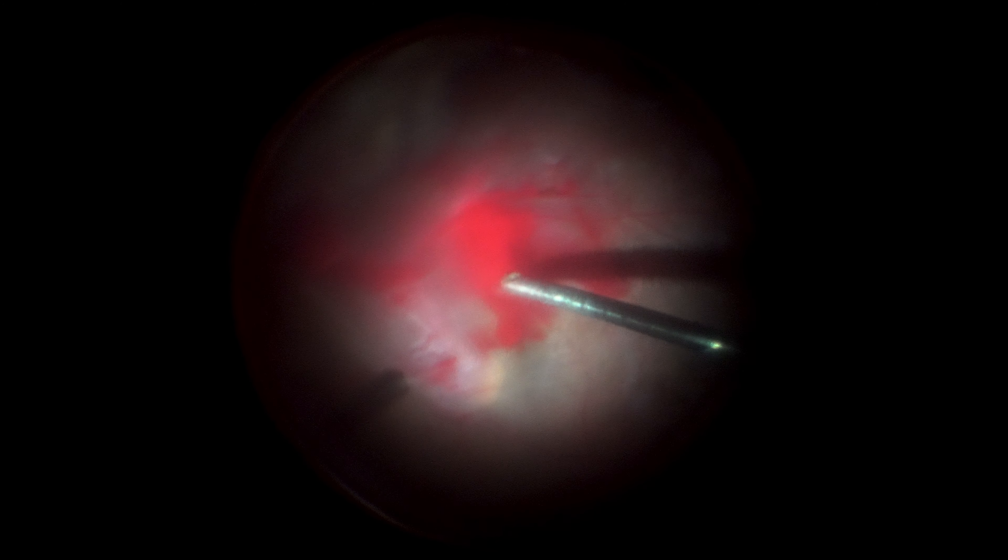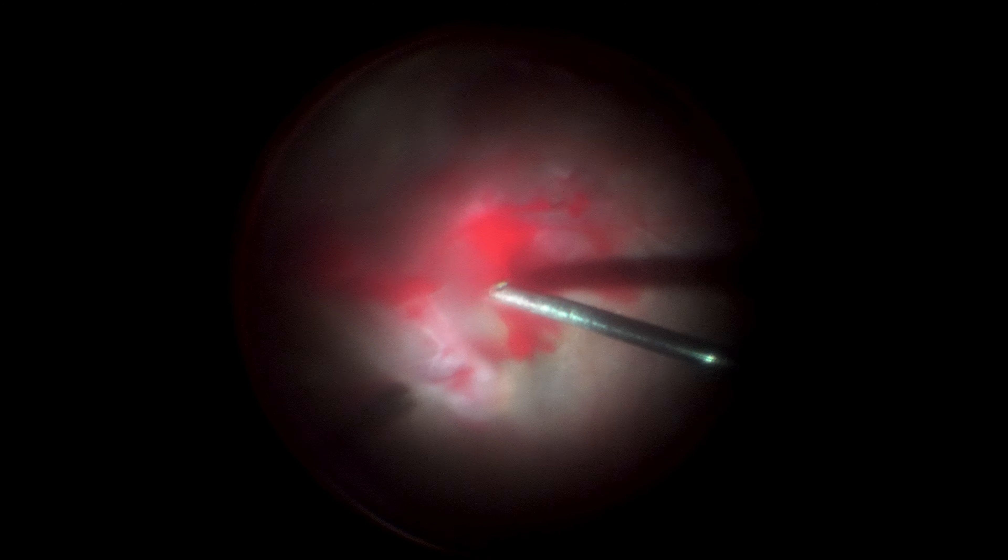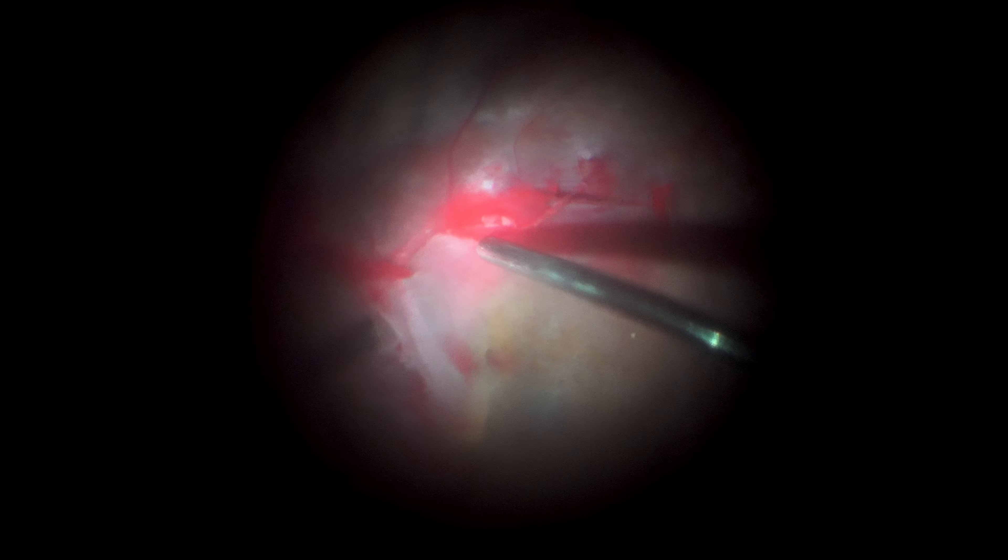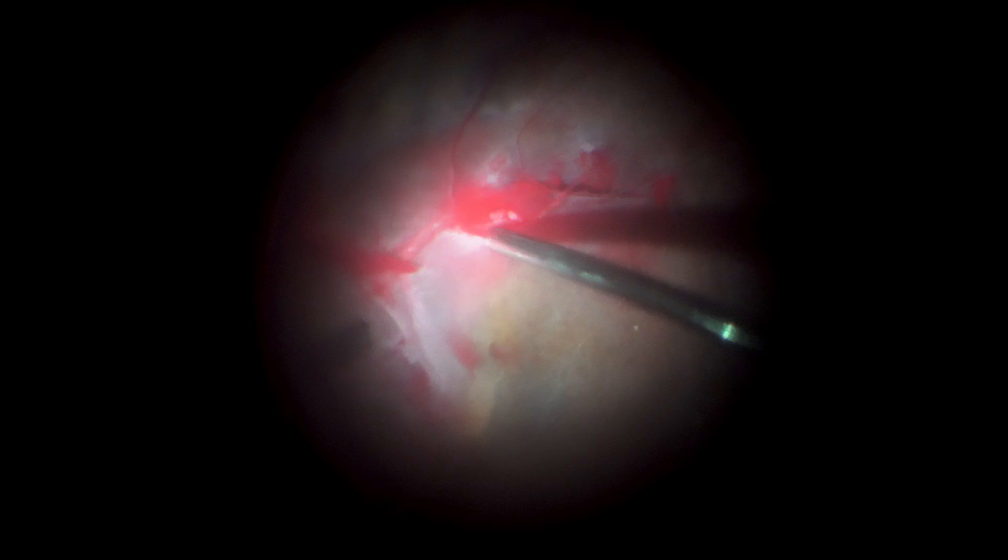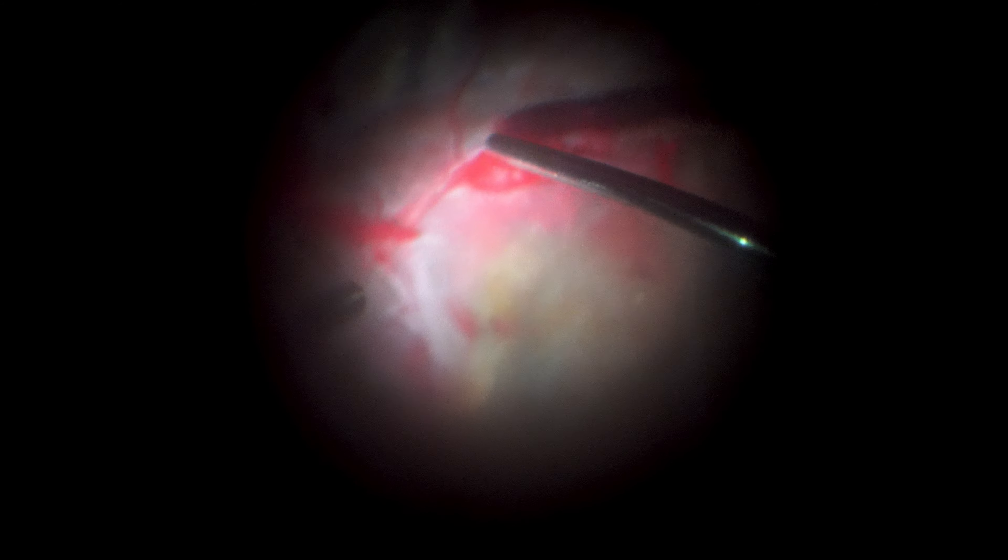A backflush cannula is used to remove blood passively. The light pipe helps with blood aspiration, bringing small clots to the backflush cannula tip. Raising intraocular pressure helps control bleeding at this time. The smaller 25-gauge tip cannula is oftentimes safer and avoids pulling on the retina.